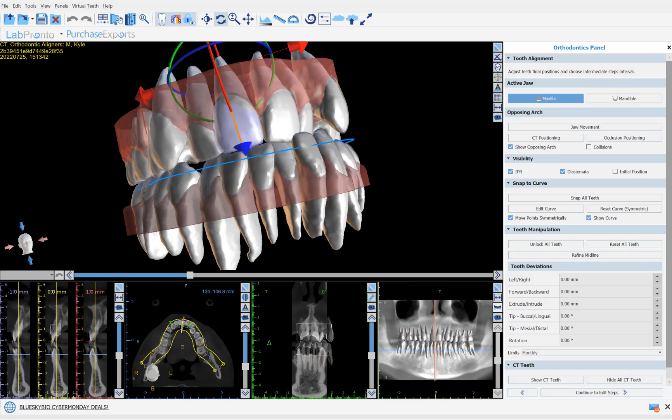This is Michael from Blue Sky Bio. In this training tutorial I'll demonstrate how to use automatically segmented teeth from your CT scan with their roots in your digital tooth setup and tooth movement for aligner treatment.